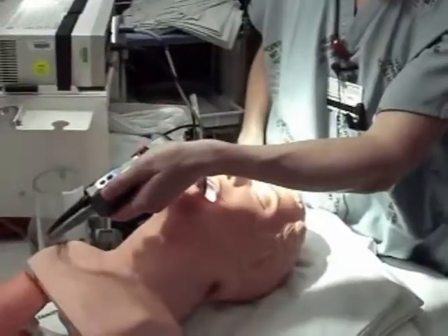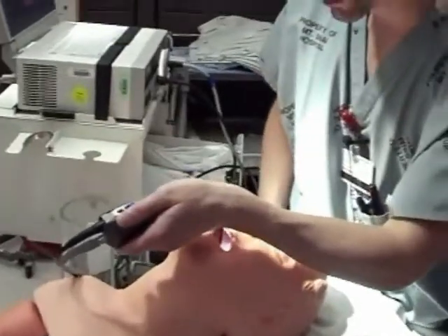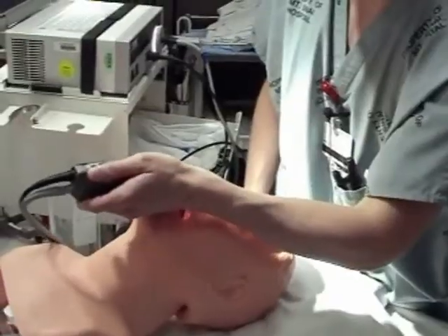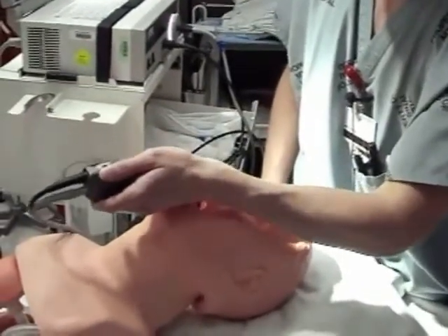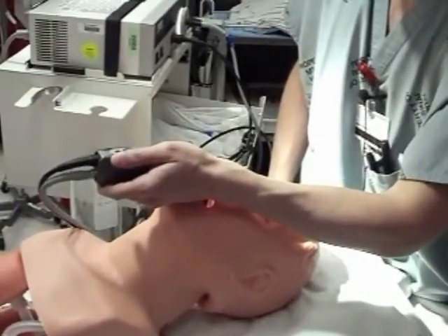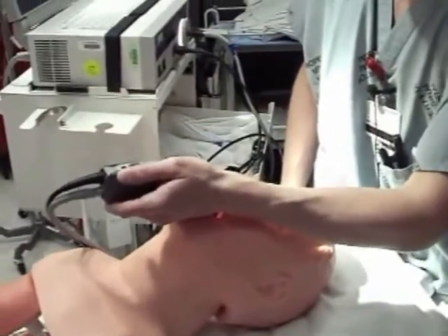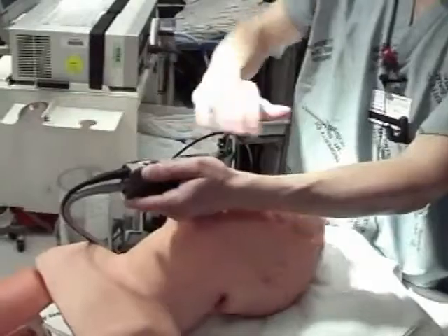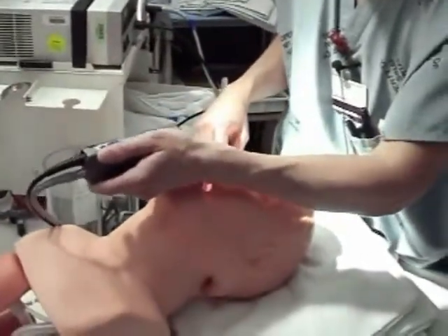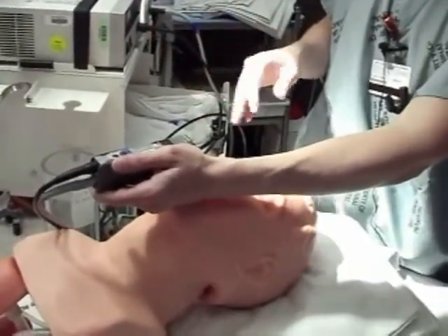The next step is to hold your laryngoscope blade very lightly and go dead center down the tongue. You're just going to inch down the tongue ever so slowly until you see a sliver of epiglottis. Right now I'm looking at a sliver of epiglottis at the base of the tongue. I'm not lifting at all — putting no pressure on the blade — just inching down the tongue until I saw a sliver of epiglottis. Now I stop, because I've completed a cognitive step.